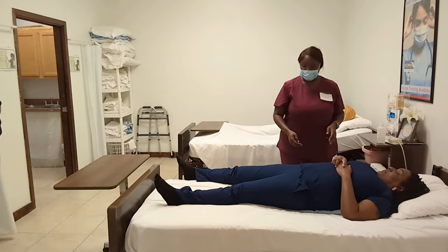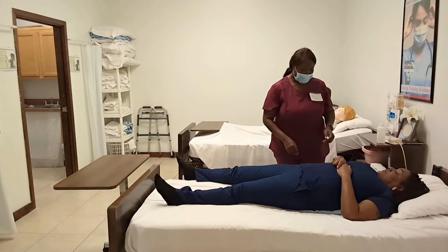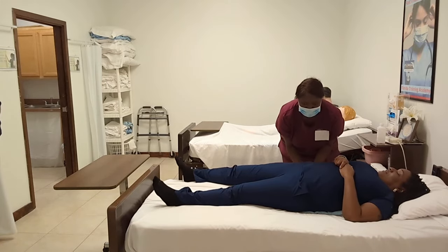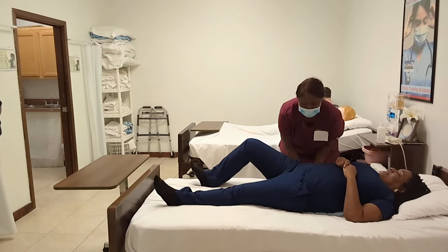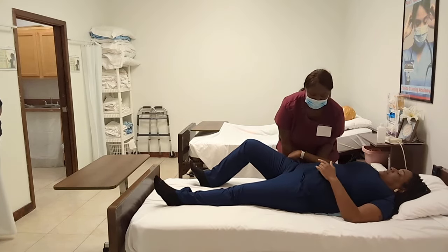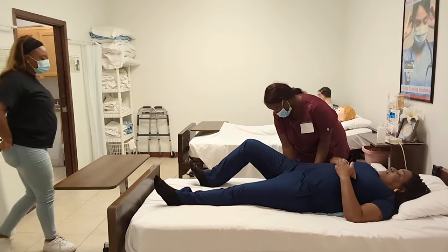You've got this. Alrighty. Okay, so I'm going to go ahead and remove it. You holding on to it? Hold on, I ain't ready yet. Wait, hold on. All y'all are trying to look up above. You need to be looking at that bedpan when you're doing this. Oh, I got it. Okay.